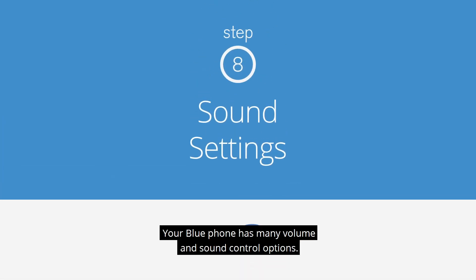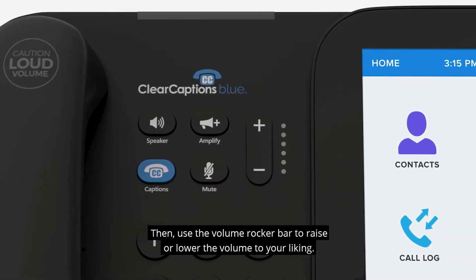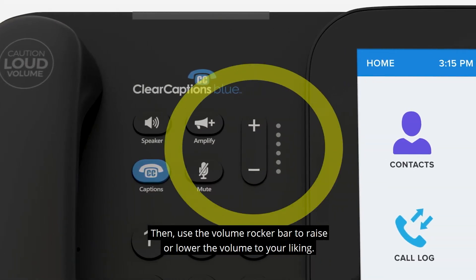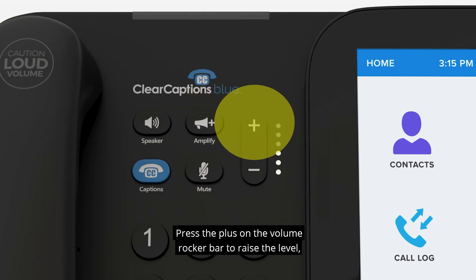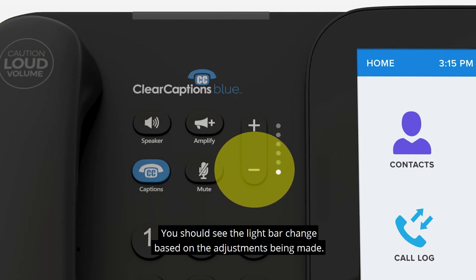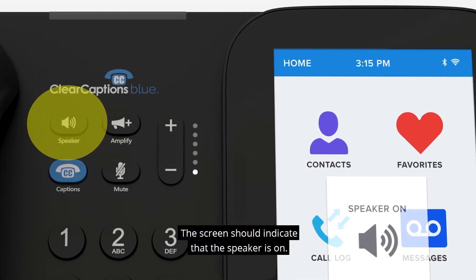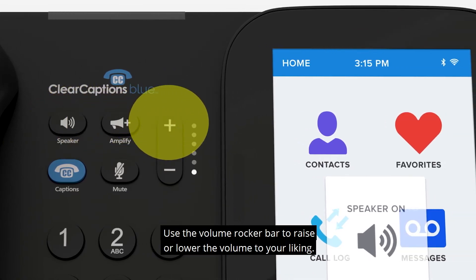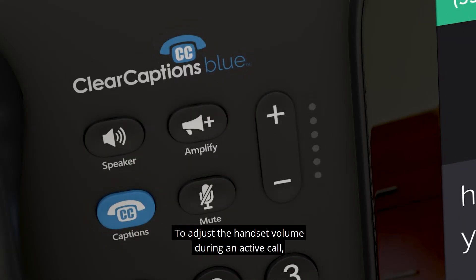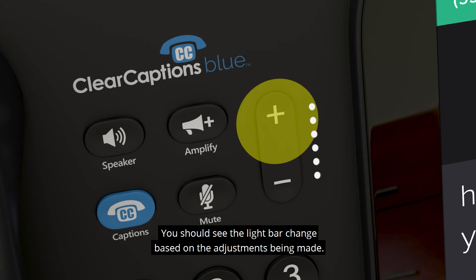Your Blue Phone has many volume and sound control options. To adjust the ringer volume, simply leave the phone on hook, then use the volume rocker bar to raise or lower the volume to your liking. Press the plus to raise the level or press the minus to lower the level. You should see the light bar change based on the adjustments being made. You can turn on the speakerphone by pressing the speaker button on the handset — the screen will indicate that the speaker is on. To adjust the handset volume during an active call, use the volume rocker bar to raise or lower the volume to your liking.